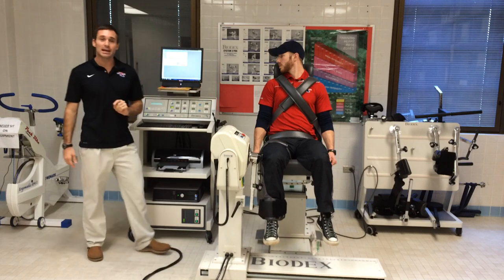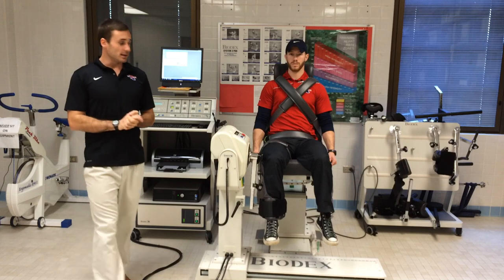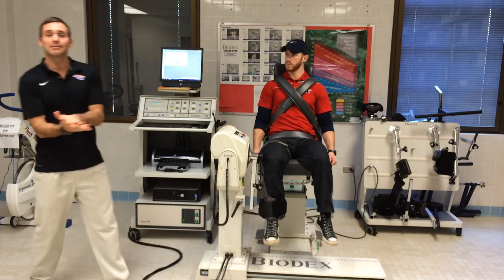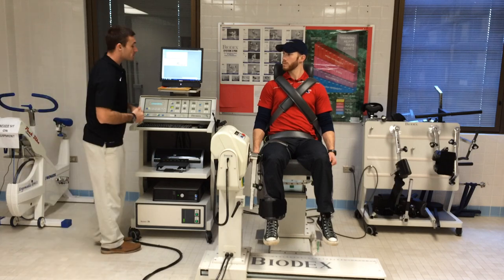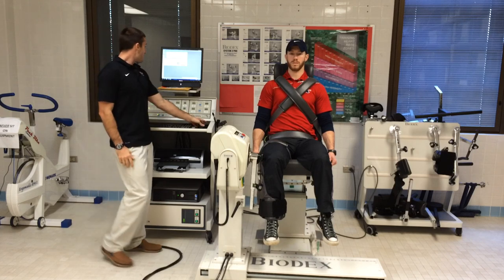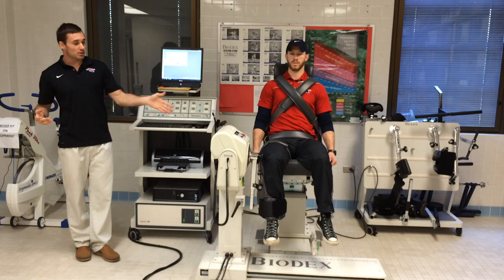Hitting continue is going to free his leg up again. We have two more things we need to do. Number one, we need to set his natural 90. What that means is where his leg is when he's just naturally letting it hang in this position. So Bo, I want you to take a deep breath. Just let your leg hang naturally. And we're going to click again that T that we clicked to set his range. That's going to naturally default to his 90 degrees.